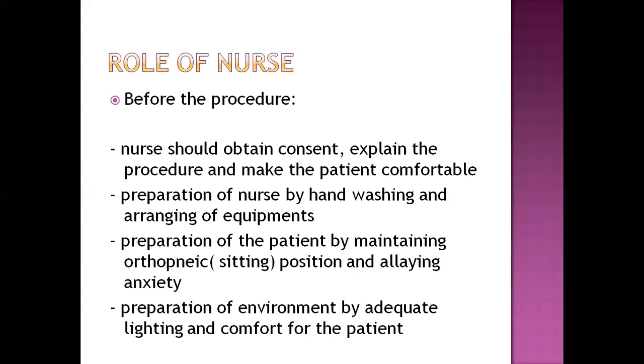Preparation of nurse herself can be hand washing and arranging all the articles needed for the test. Preparation of patient can be by maintaining correct position. For this procedure, orthopneic or sitting position is the correct position, and allaying anxiety of the patient. Next is preparation of environment.